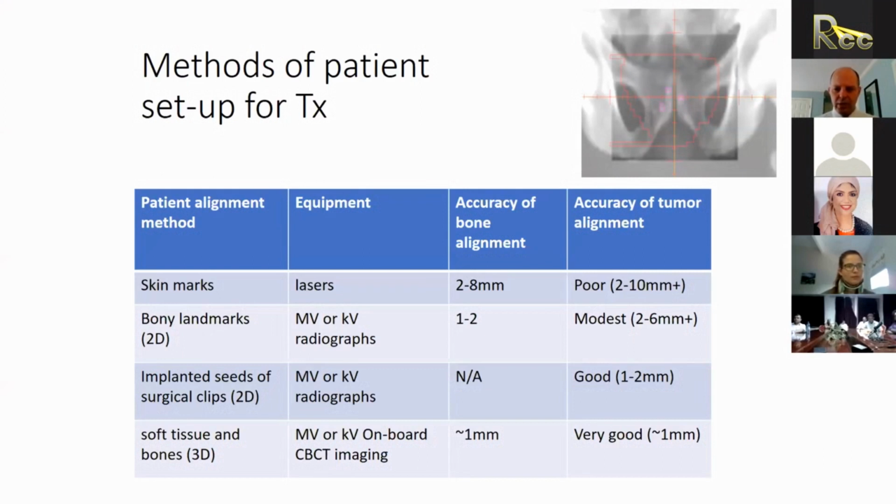That's right. Your gantry typically takes a minute or two for a rotation, so you may have 2 minutes just for the rotation where the data is acquired, but then you also have to reconstruct that, and that'll take a couple of minutes. Depending on the system, some systems allow you to select a smaller field of view, like superior to inferior.